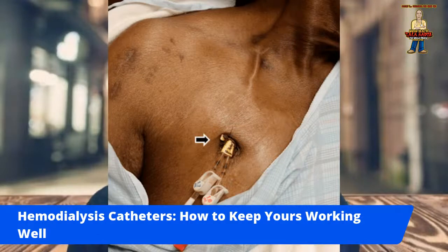Keep an emergency dressing kit at home. Okay, very important. You can get these kits or find bandage changes at pharmaceutical stores, medical supply stores, Amazon, places like that, in case you need to change your dressing in between treatments.